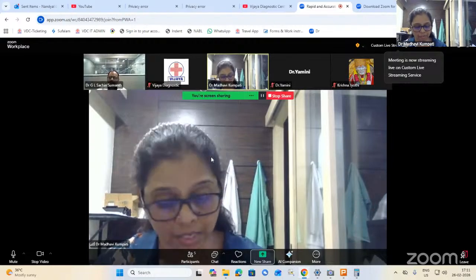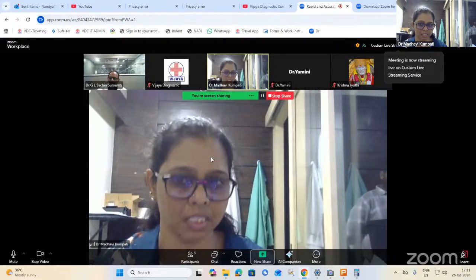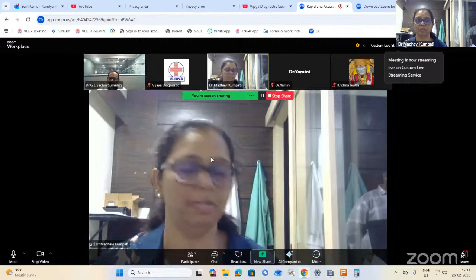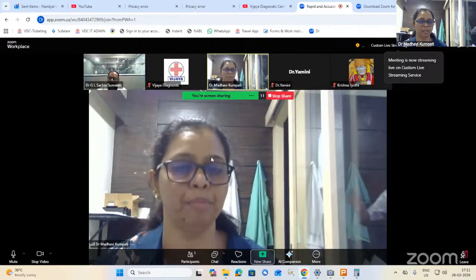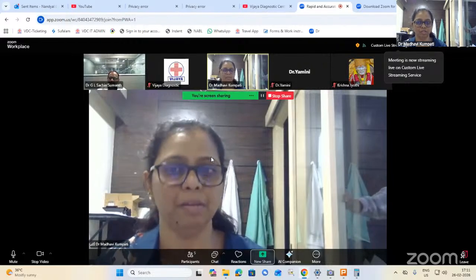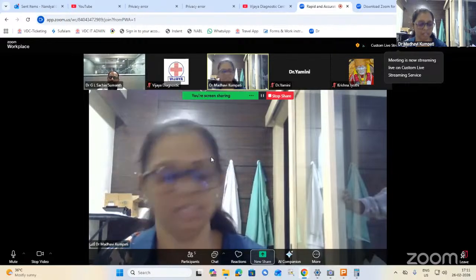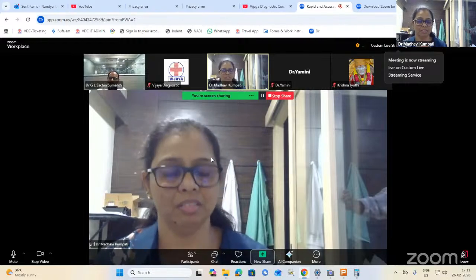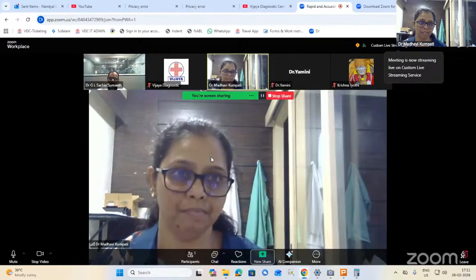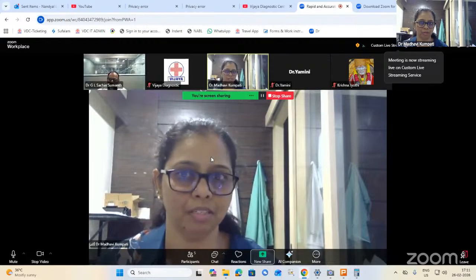So it's very important that the clinician or the person who's drawing the blood culture understands that a blood culture bottle has to be filled appropriately with the correct amount of blood, so that we recover the pathogens correctly. Because as we know, in a septicemia, the load is really very less. And unless we have the amount of blood that we require, we will not be able to isolate a pathogen from the blood culture bottles as such.